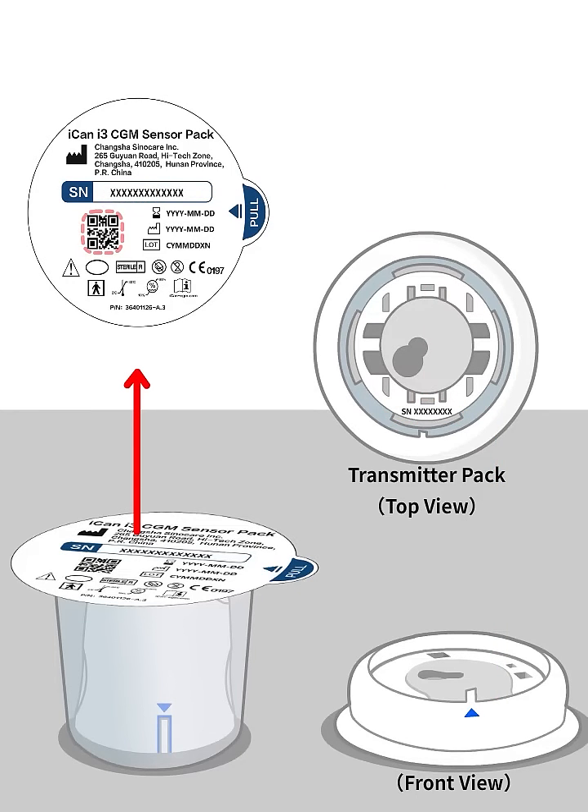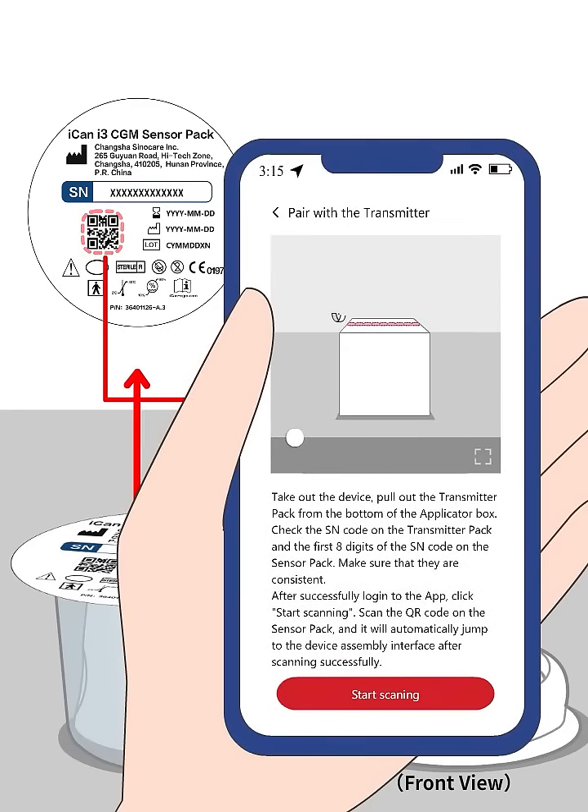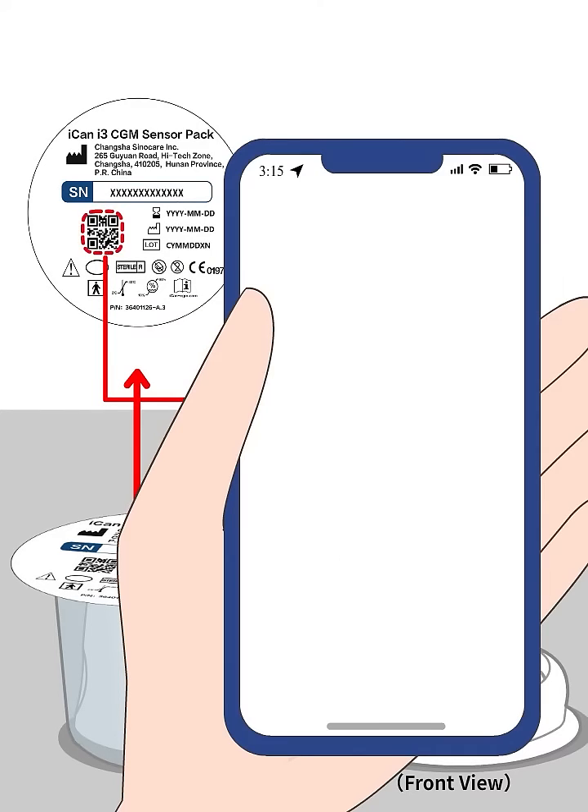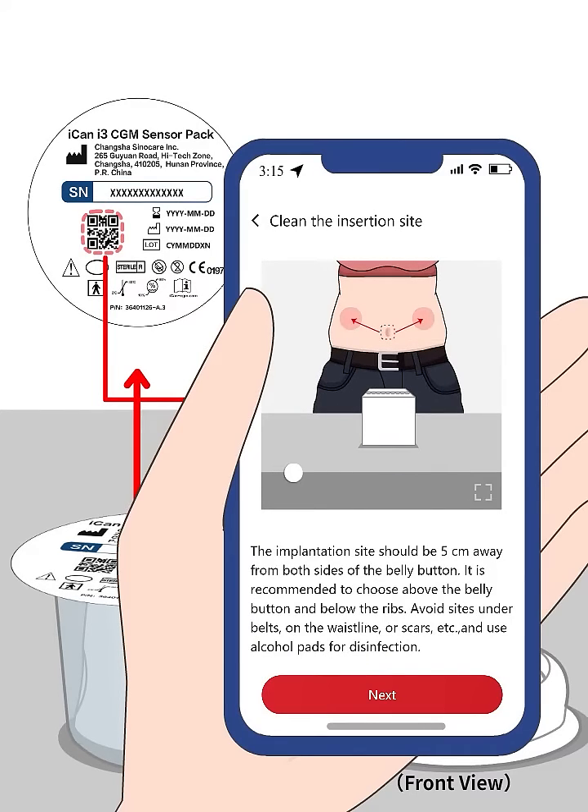After successful login to the app, click Start Scanning at the bottom of the screen. Scan the QR code on the top of the applicator box with your mobile phone and it will automatically jump to the device assembly interface if the scanning is successful.